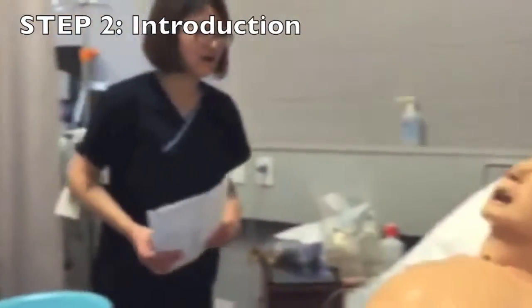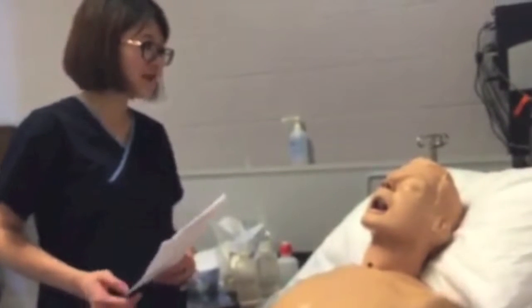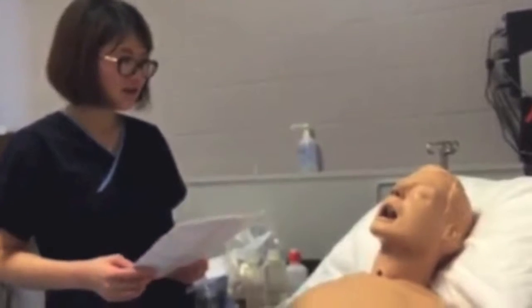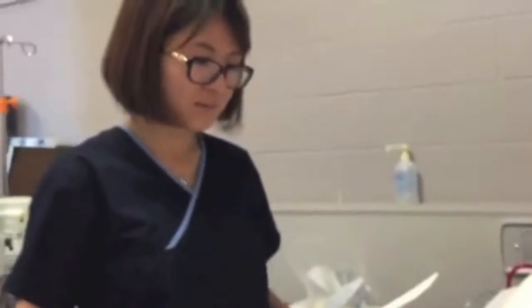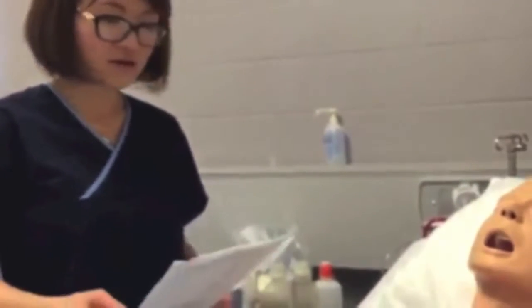Introduction. Center yourself, assess the situation, introduce your role, check the patient's identity, name any concerns, give information, confirm confidentiality, advise of the right to decline, and recheck understanding and ensure consent. For initiating a peripheral intravenous infusion, assess the patient's experience with IV therapy and arm placement preference.